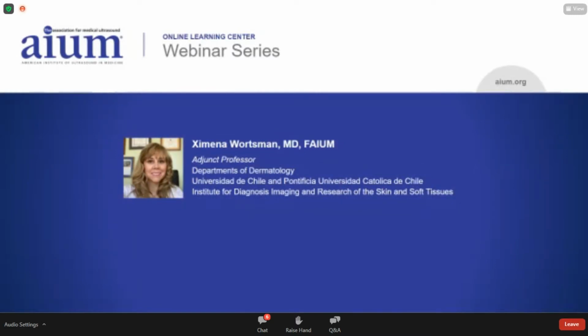Yes, you're right. I didn't show too much pulse Doppler because we didn't have too much time. But the protocol of dermatological ultrasound examination includes the grayscale, the color Doppler, and the power or pulse Doppler for all the examinations. So if you look at the literature, you will see that. I didn't show every image because we take a lot of images, but of course it is important to use the pulse Doppler and the power Doppler.